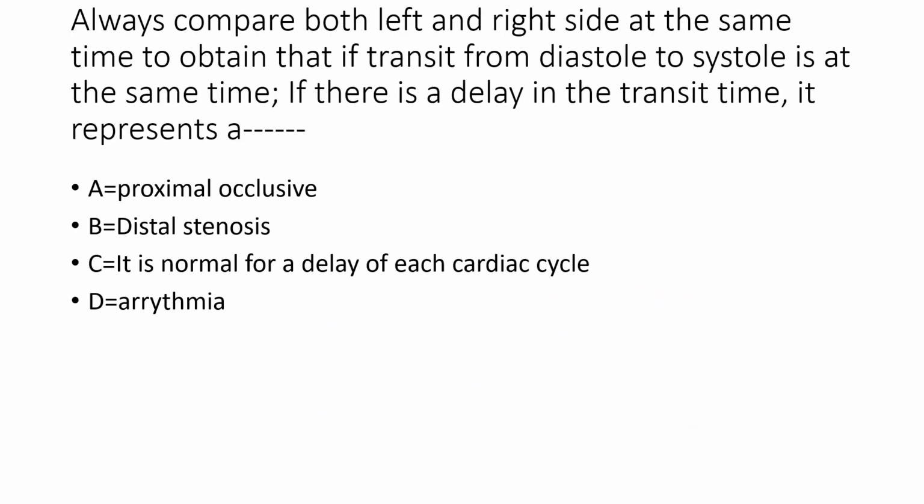Always compare both left and right sides at the same time. It means you have to probe and compare the right carotid with the left carotid, or the right common femoral or superficial femoral with the left superficial or common femoral at the same time.